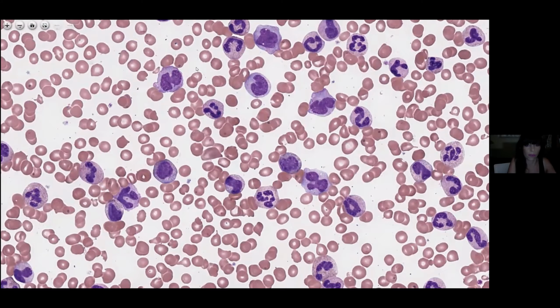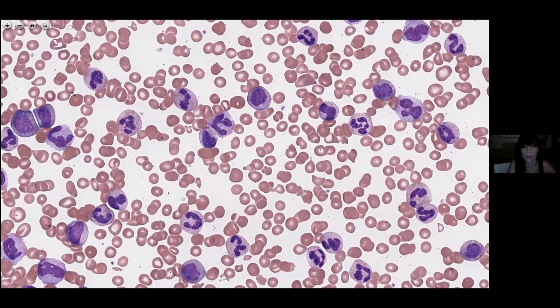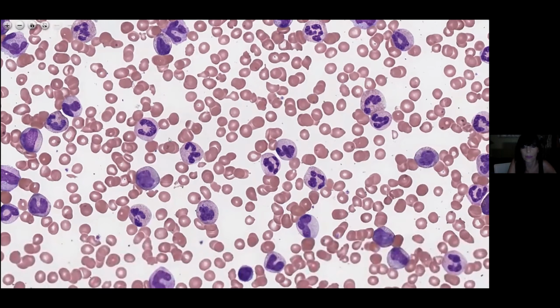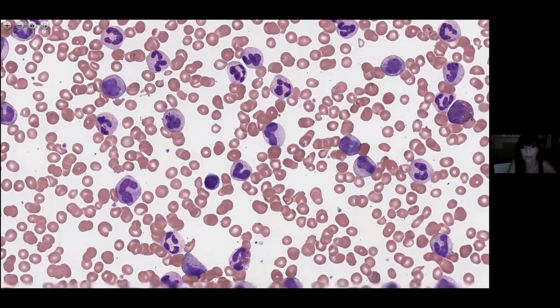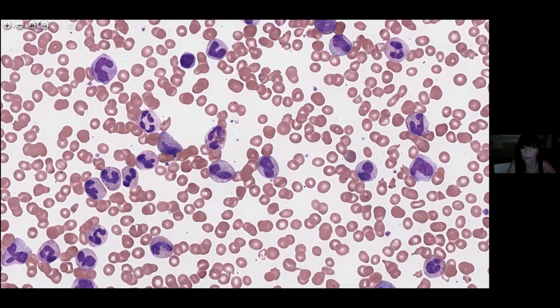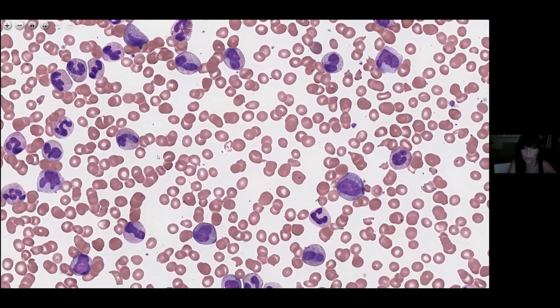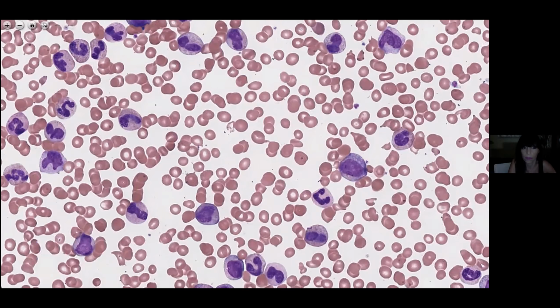And a basophil, I'm very interested and really want to know what the basophil count is, because it tells us whether there could be a possibility of accelerated disease. And there are some prognostic scores for CML which rely on the basophil count. There's one in particular which I tend to use, something called the EUTOS score. So from a clinical perspective, those are the main things. But I think the features that you've described and the case has been excellent, really.